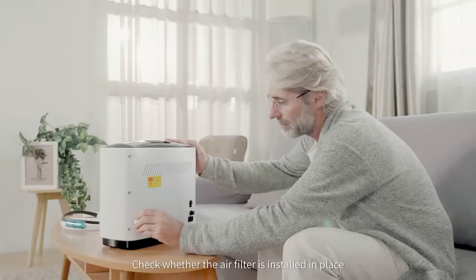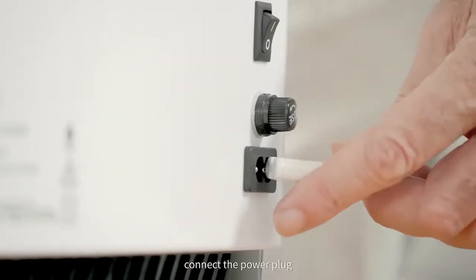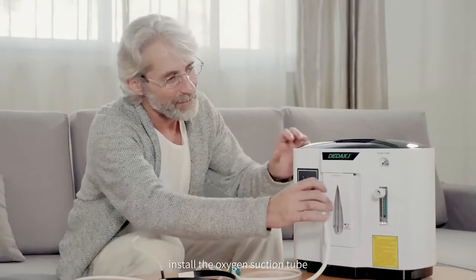Check whether the air filter is installed in place. Connect the power plug. Install the oxygen suction tube.